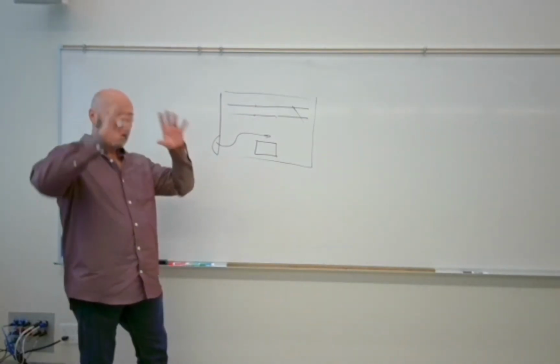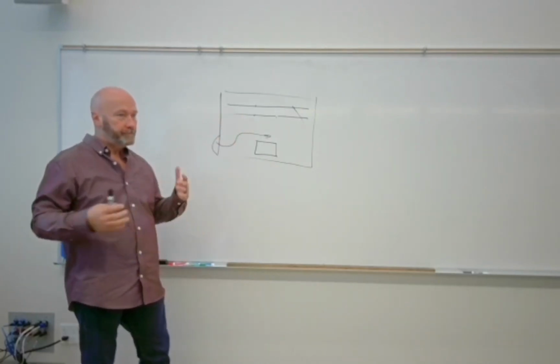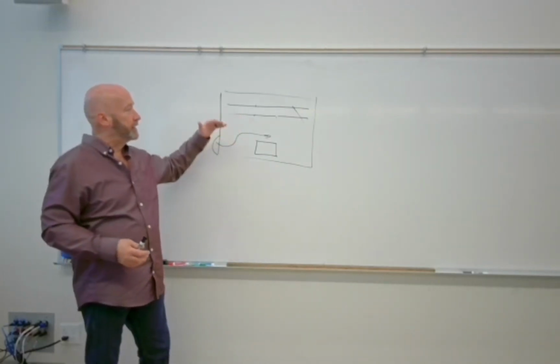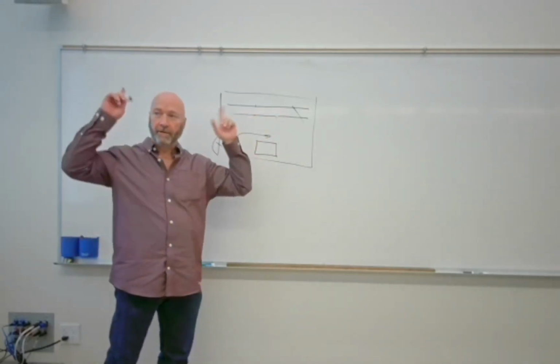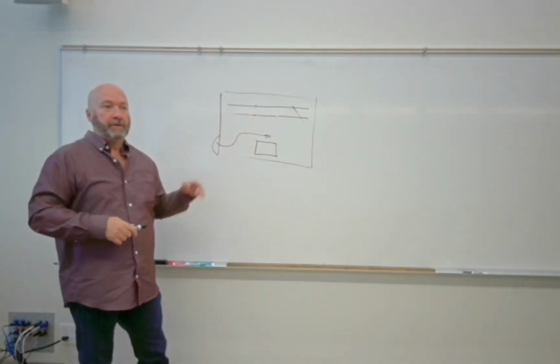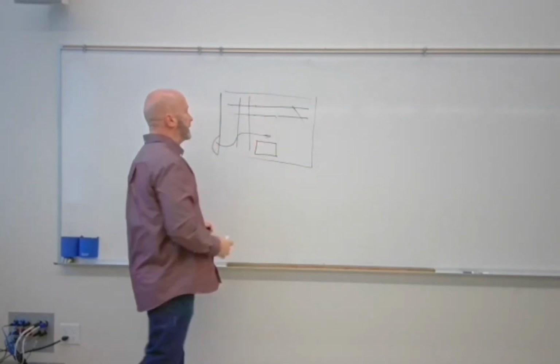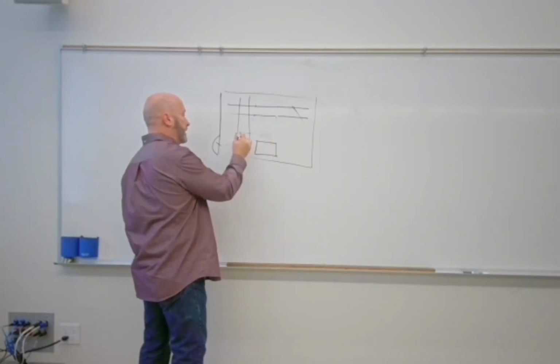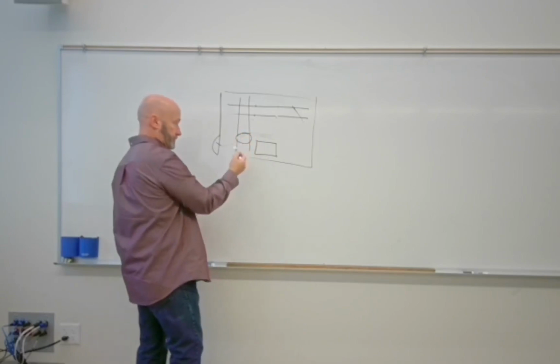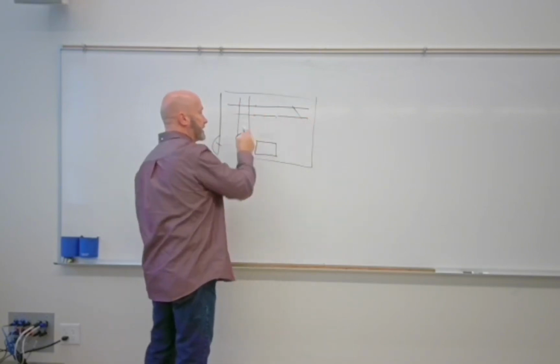So there's a lot of stuff that you don't see that goes into the support system. We're not going to really test on that, but the support system that you can see are these two things that are screwed into all that stuff that's in the ceiling, right? And then you've got another set of rails that run exactly perpendicular to those, and that is what your control tower with your X-ray tube hangs off of. So your X-ray tube is off of that control tower. So the control tower runs on this set of rails, which in turn runs on that set of rails.